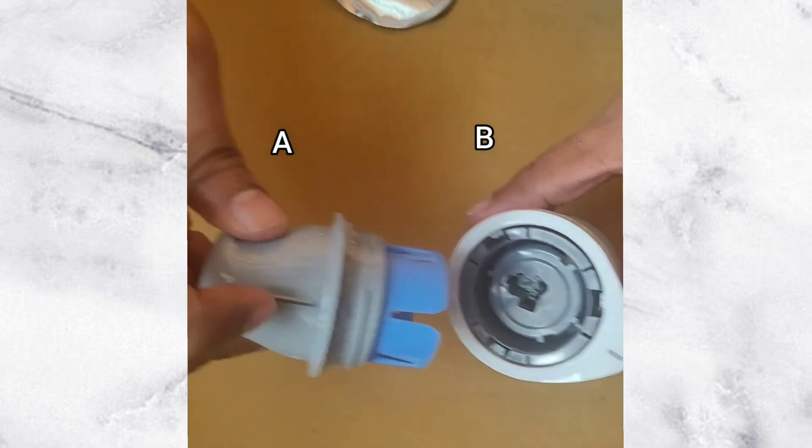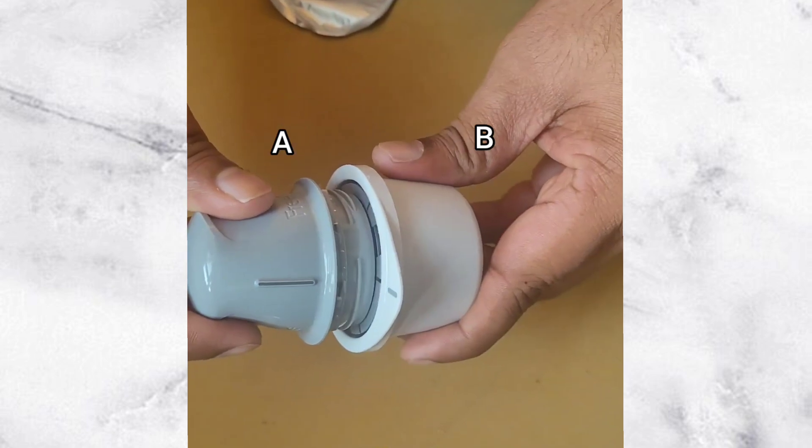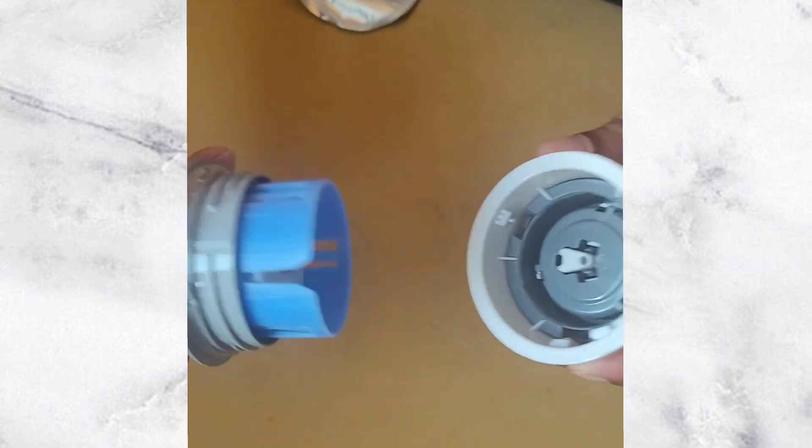Now align the line on part A with part B and firmly push part A onto part B. The sensor is now on the sensor applicator, which is part A.